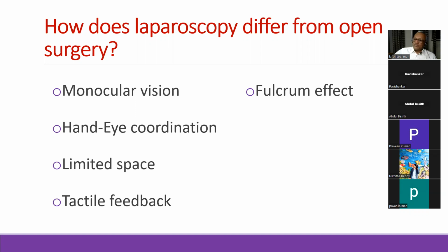All right, that's important. So it depends on where the fulcrum is in terms of the intra-abdominal versus the extra-abdominal length of the instrument. And if the fulcrum is exactly halfway in the instrument, then there won't be any change. It will move inside the abdomen as much as you move outside the abdomen. You got that? Yes, sir. Yeah, that is the fulcrum effect. What do I mean by tissue approximation?